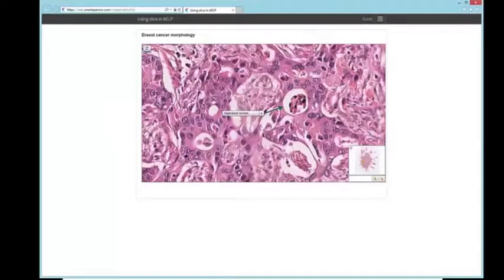And so that was a one slide example of how you can create quizzes or assessments or tutorials using the platform that make use of all the images that are available to you in Slice. And I guess the final thing to say about that is that obviously you can use that tool in assessment, and we have used that in summative assessments at UNSW. My colleagues have, where over 500 students were involved, and I think they told me that to write the assessment took them about 10 hours, and it saved them about 50 hours of marking. So that's another use in which all these images can become available in pretty sophisticated assessment tools.